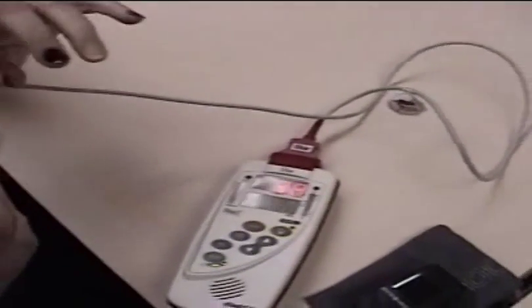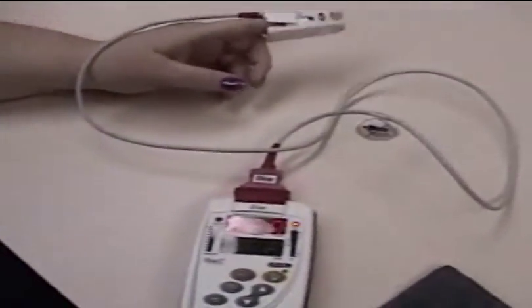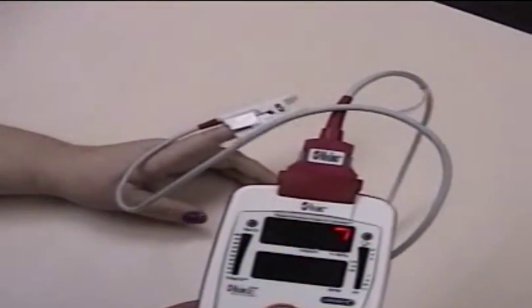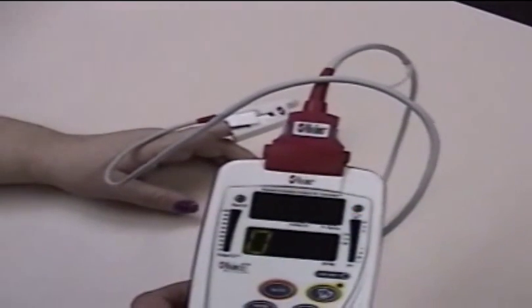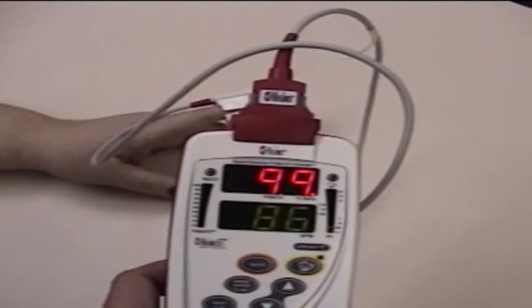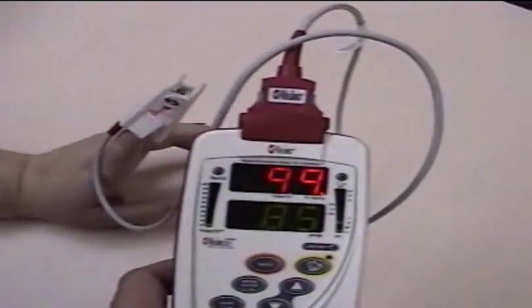So let's go ahead and switch it to black. Readings are coming in at 99, 100, 99.